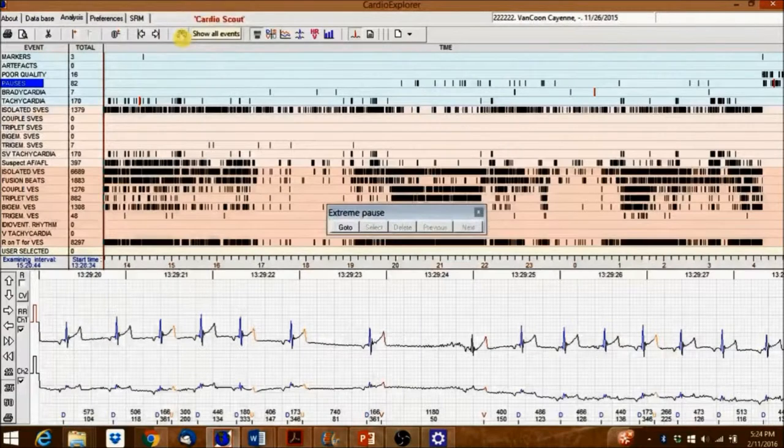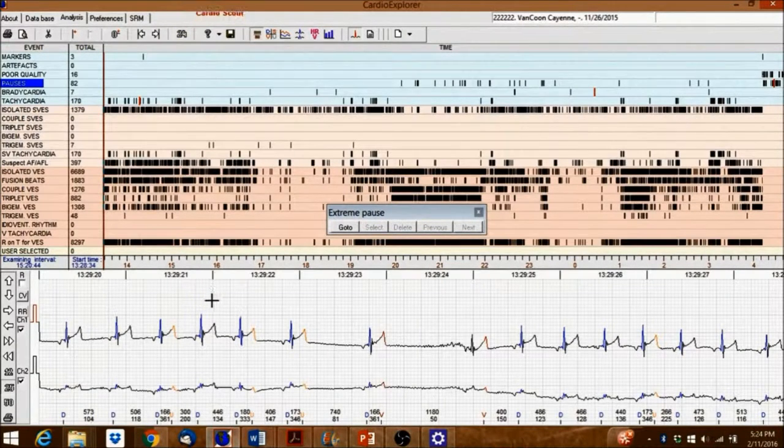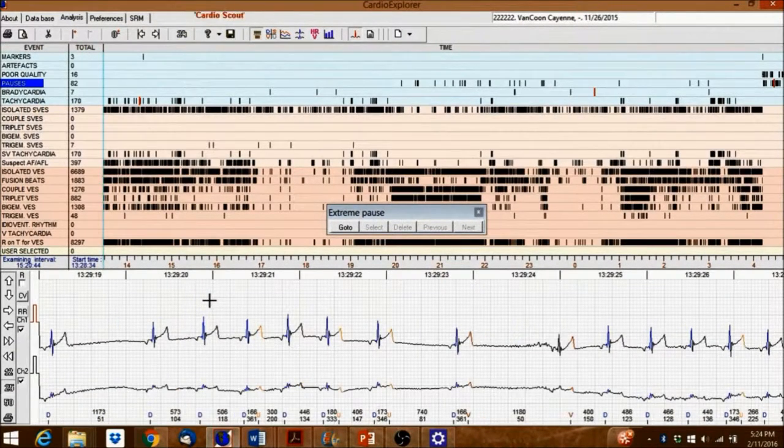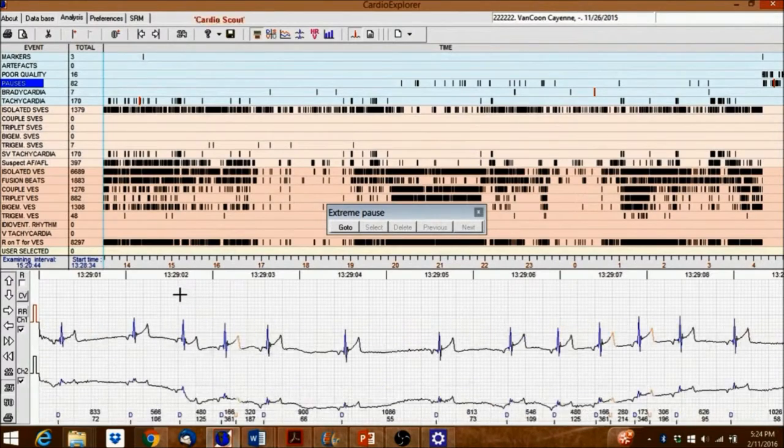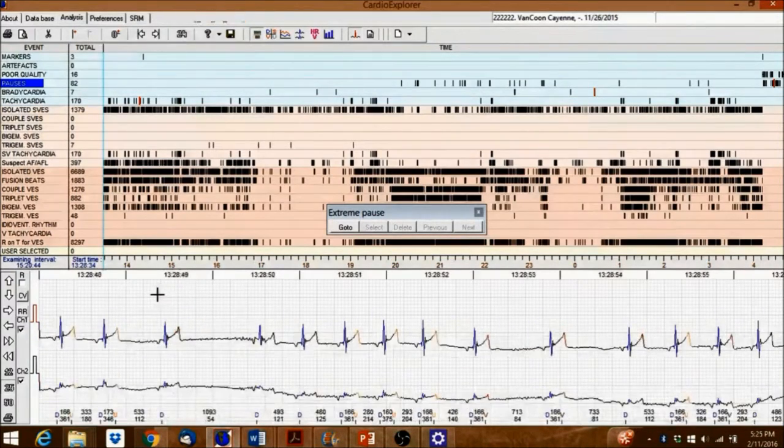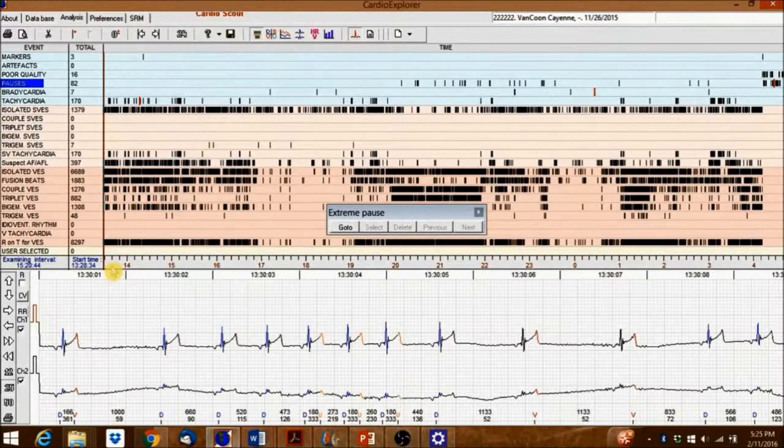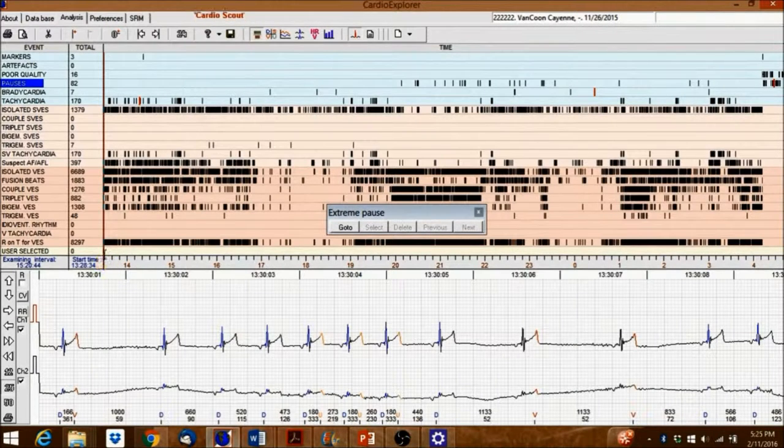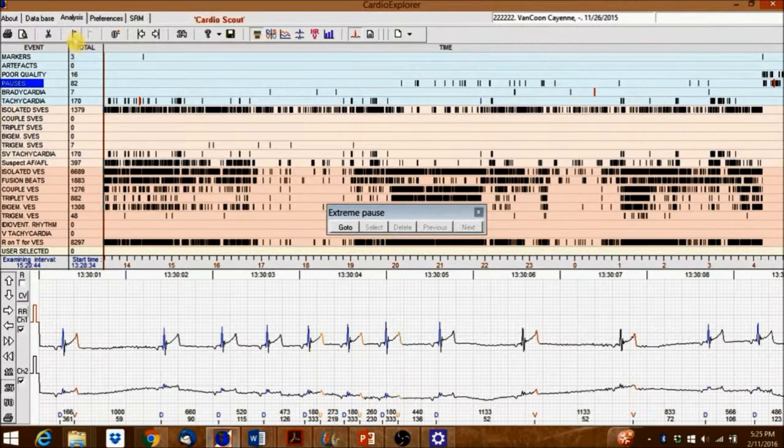Right-clicking and dragging here will allow you to move quickly through the recording. Click on the Add Marker icon at the top to add a timestamp marker.